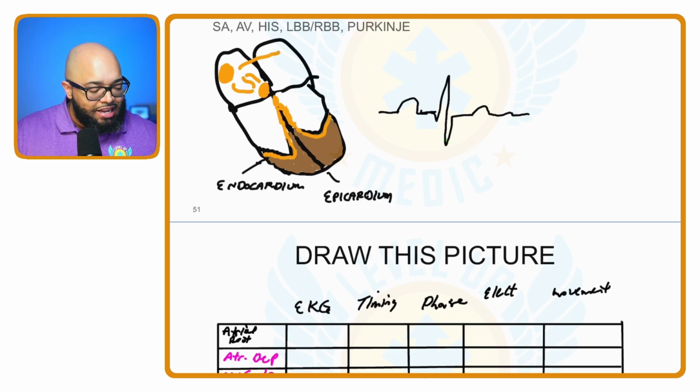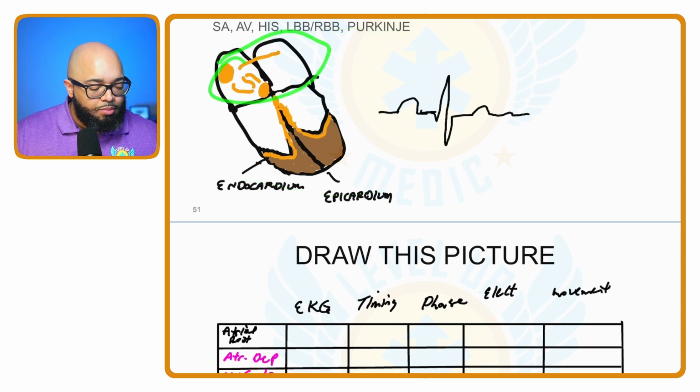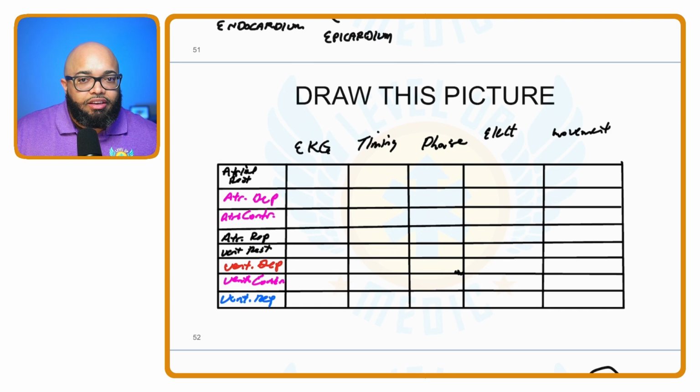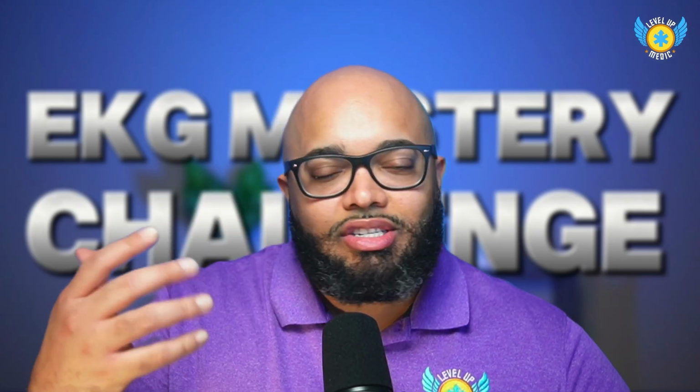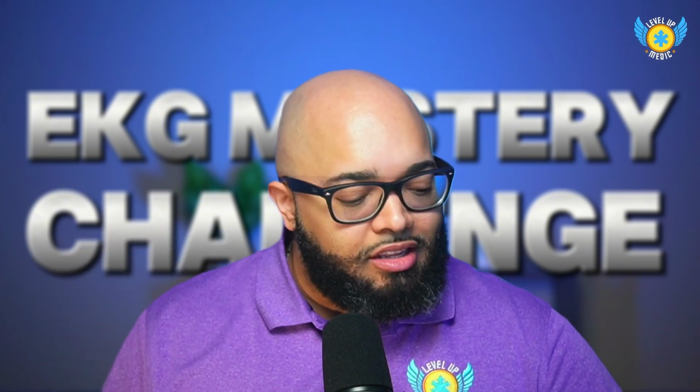But now that we have both of these side by side, I want you to literally picture the heart and how the signal moves from the top chambers of the heart through the junction to the bottom chambers of the heart. I just drew this out quickly for you, so it is not in your workbook already because I only did this during the break. Just watch me tell you the story, and then you can take a picture or a screenshot, whatever you want, to have all of this summarized nicely in one place.